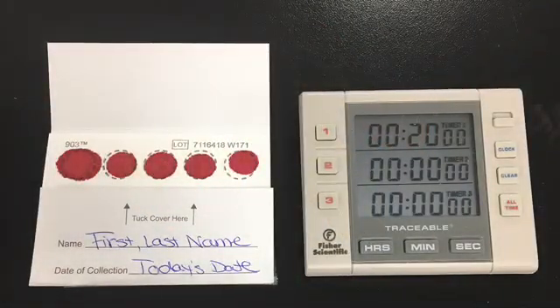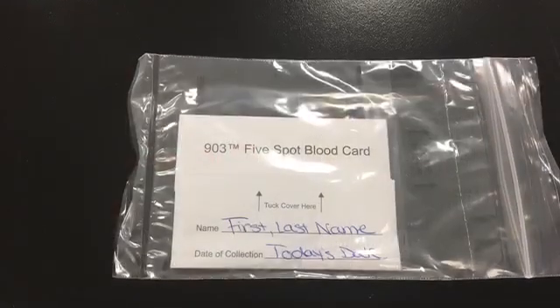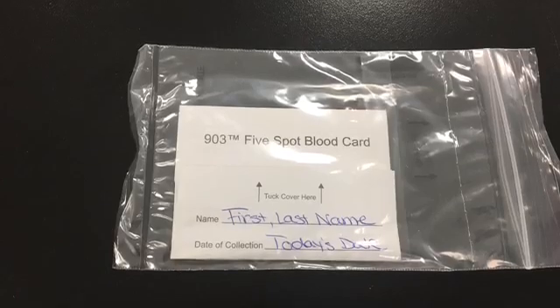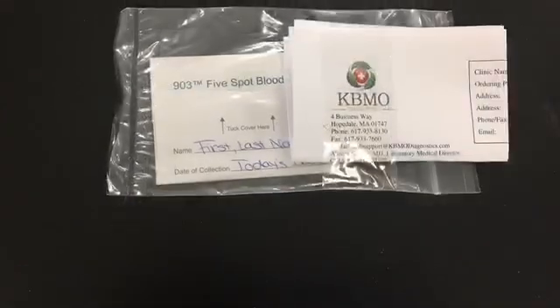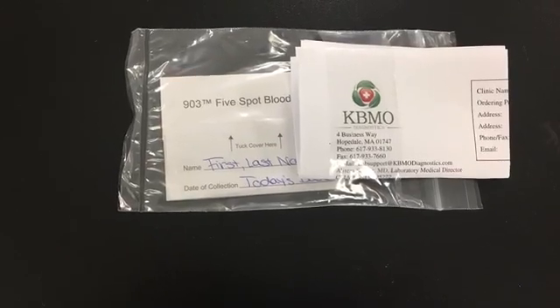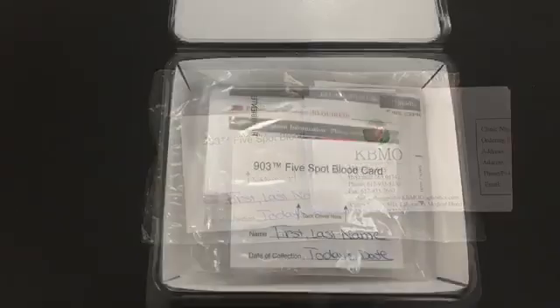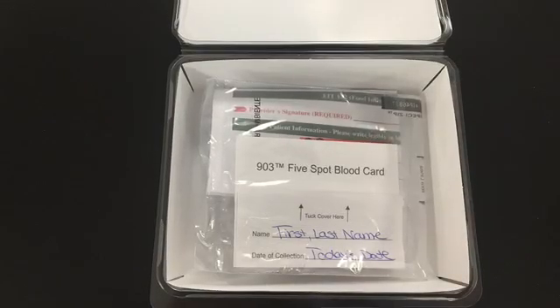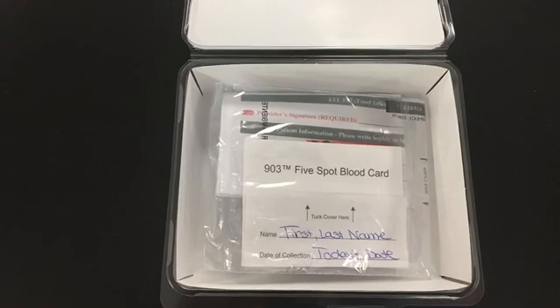Allow the card to air dry for 20 minutes. Put the blood spot card into the biohazard bag. Place the completed patient requisition form in the outside pouch. Return the biohazard bag and its contents to the plastic fit kit casing if available.